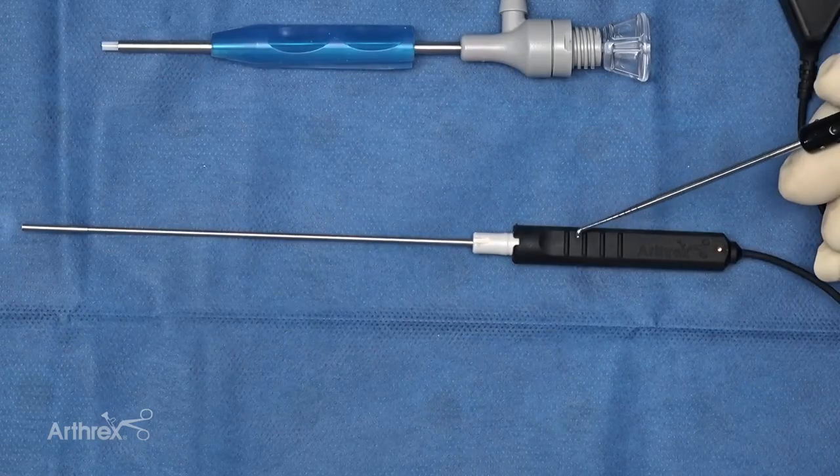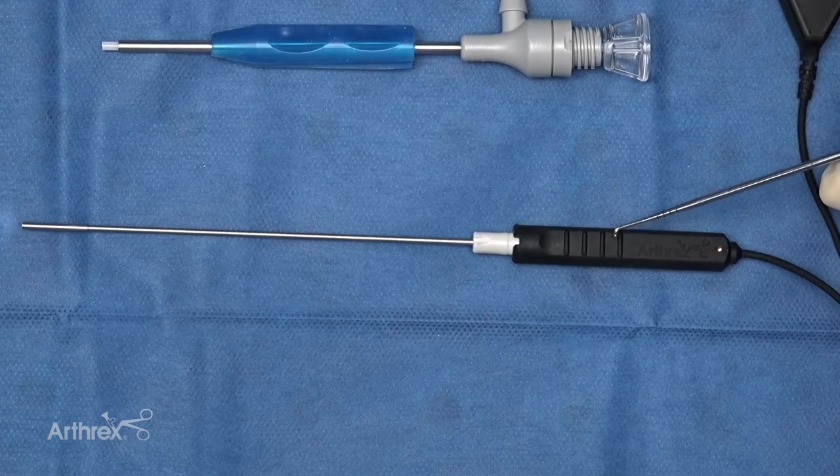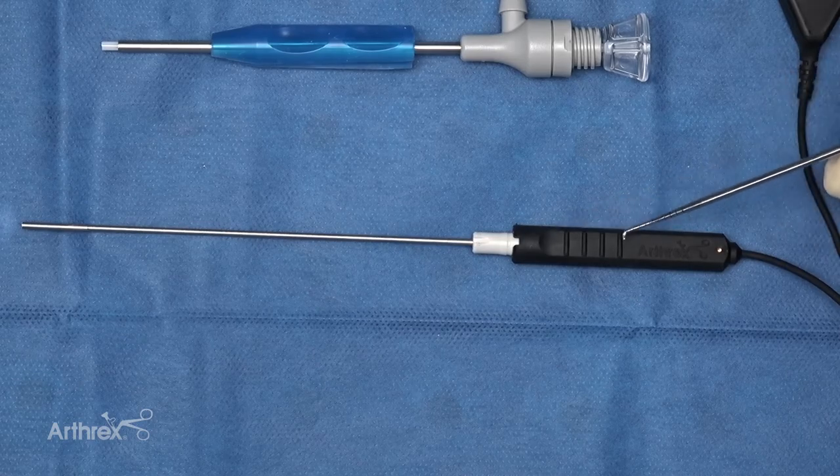These small ridges are the north/south indicators, so the surgeon knows which way is up and which way is down, giving them proper orientation without looking — compared to our previous scope.